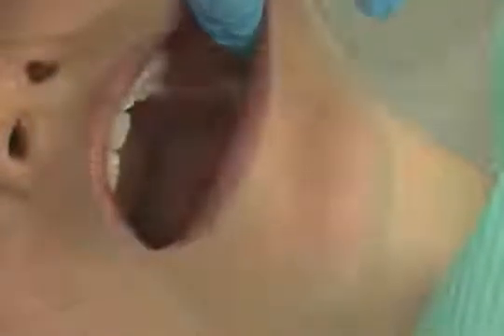We're going to do the long buccal nerve block. The nerve involved is the buccal nerve. The areas to be anesthetized are the soft tissue and periosteum of the mandibular molar teeth. Your needle gauge and length is a 25 or 27 long.